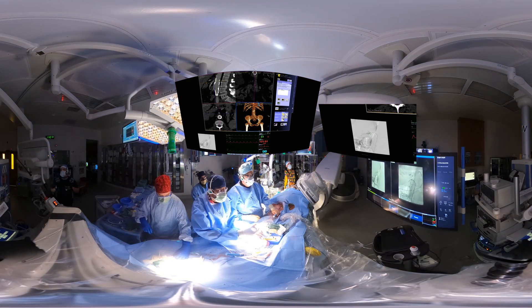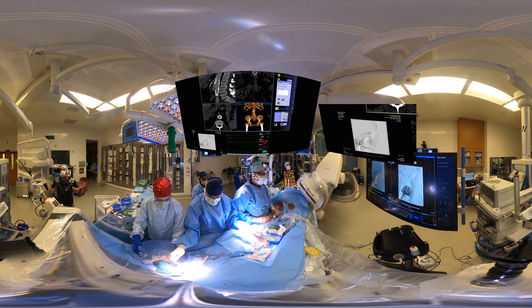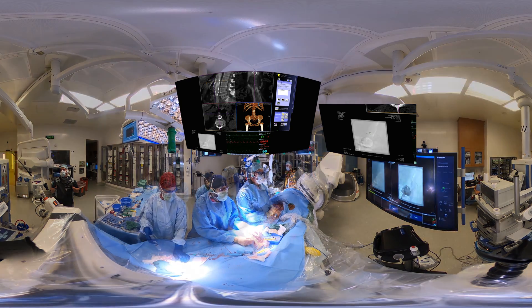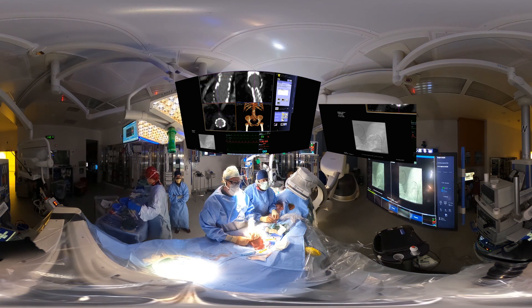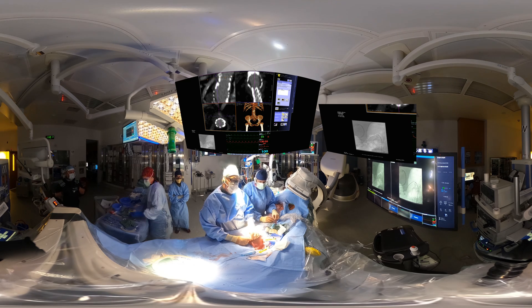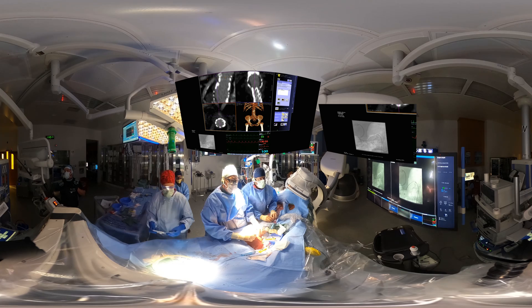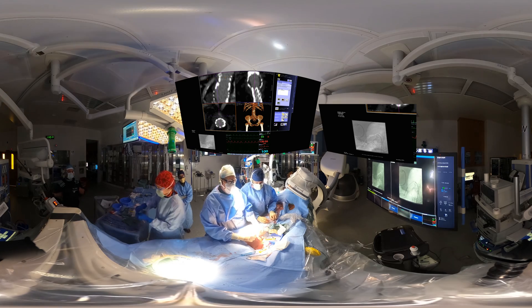Now we're actually advancing up. We're using a tour guide to help us catheterize. We've got fused imaging, so the origin is all marked, and we're using the tour guide to actually help access this. We've crossed the lesion with a glide wire and pre-dilated the lesion.